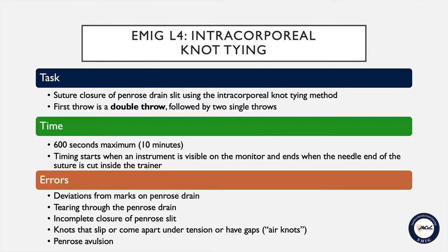You will be provided with a piece of suture that has been cut to 15 centimeters in length on a curved needle. You will use this suture to close the opening in the penrose drain utilizing the intracorporeal knot tying method. Your first throw is required to be a double throw, followed by two individual single throws.